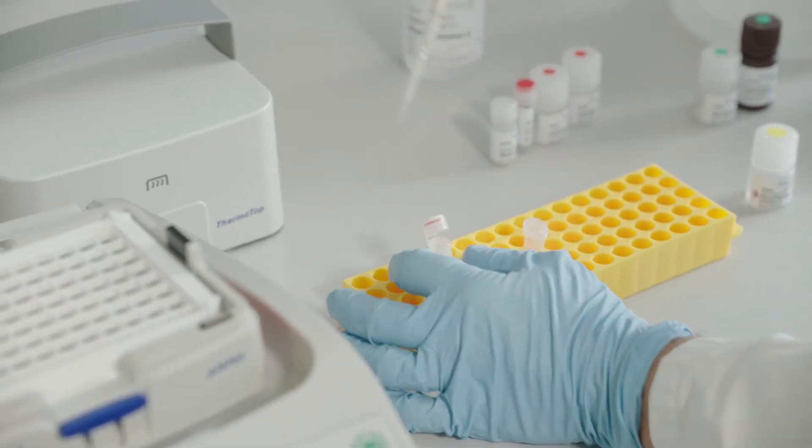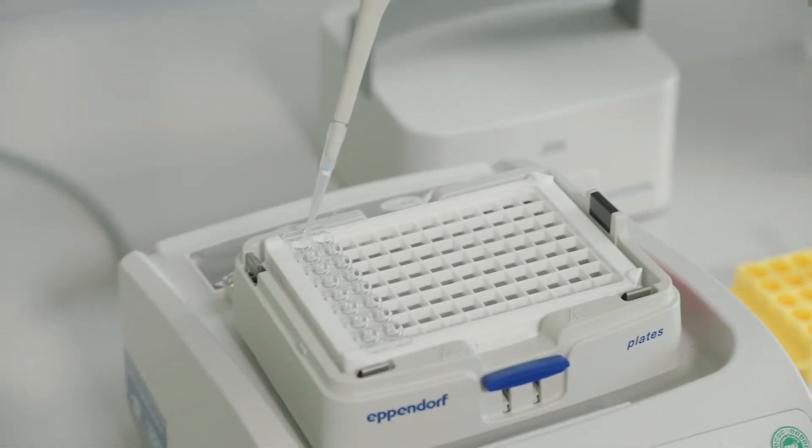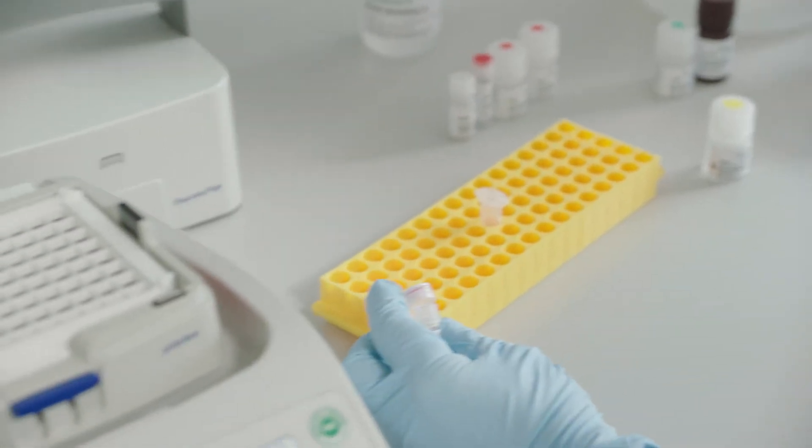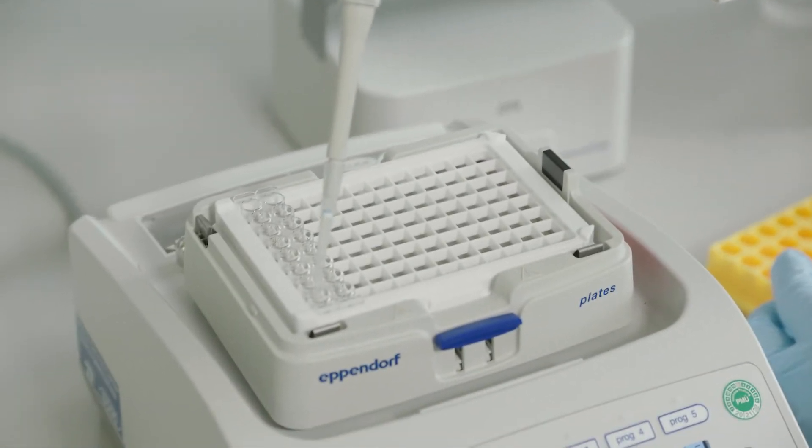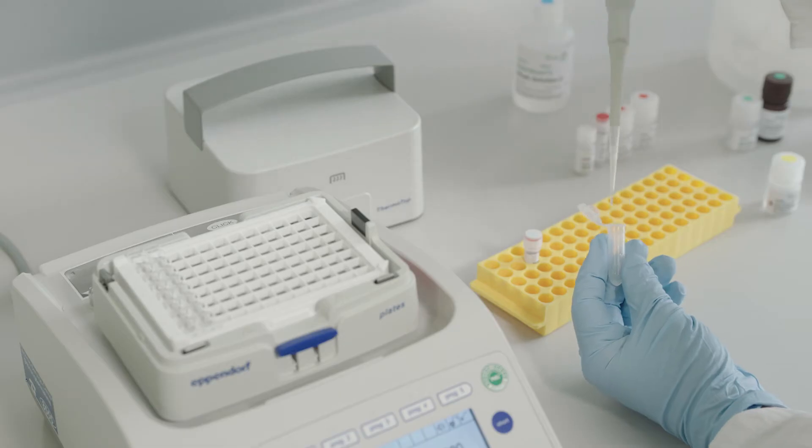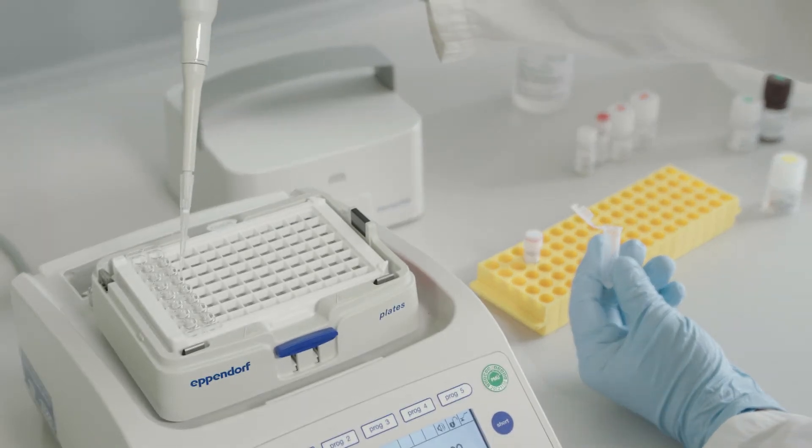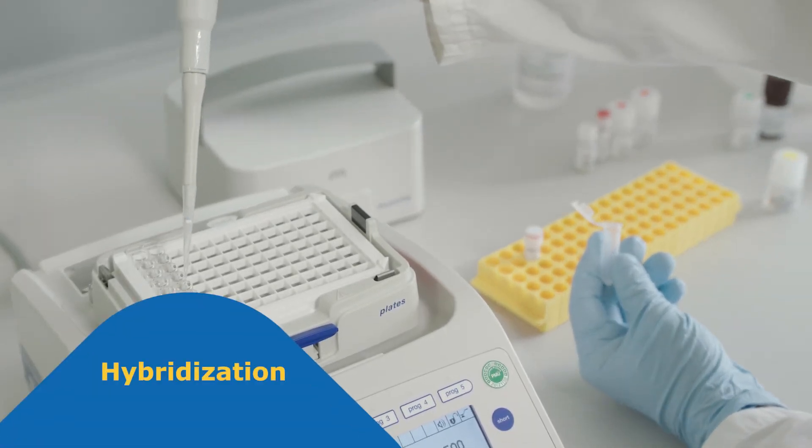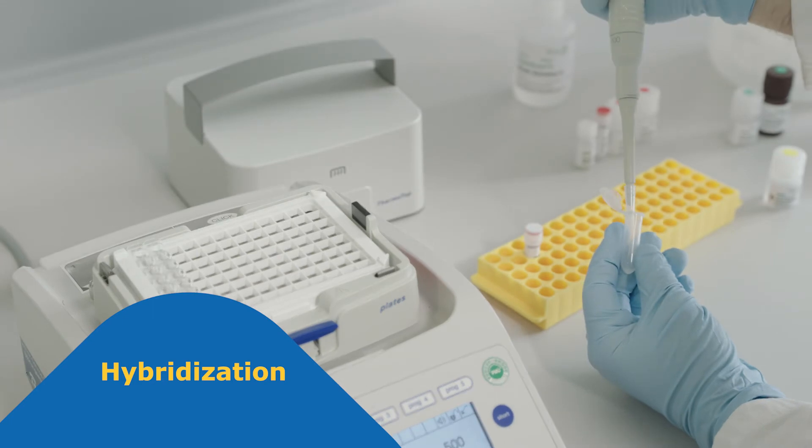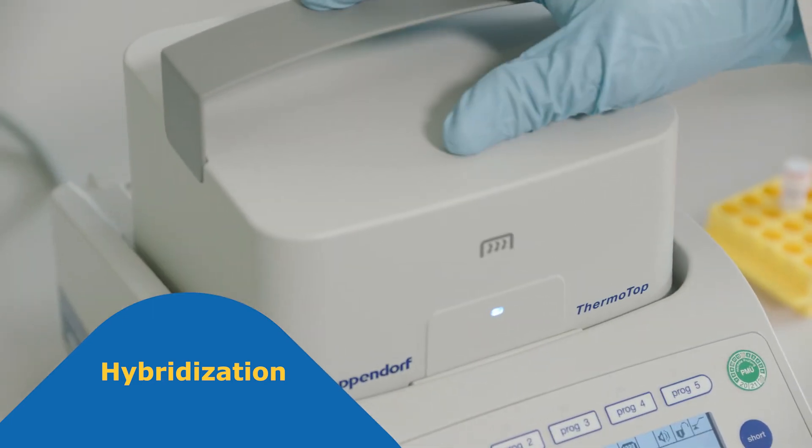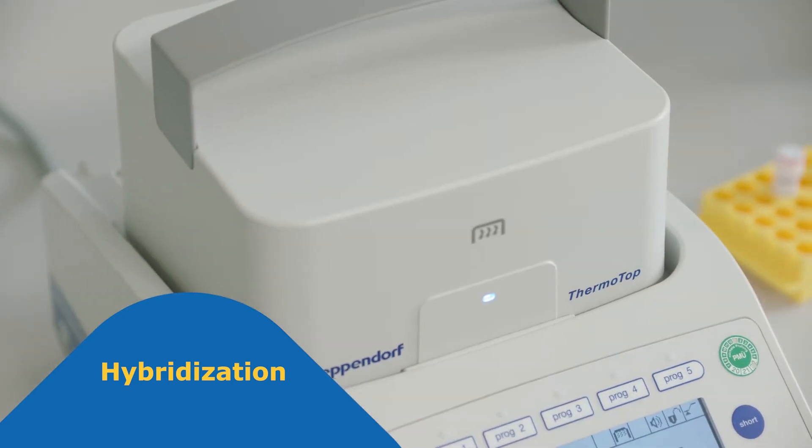After centrifugation, the RNA is in the supernatant. For hybridization with the probes to form a sandwich complex, RNA-containing supernatant and standard solution are added to the corresponding wells of the prepared microplate, which is then covered with a lid and incubated for 10 minutes.